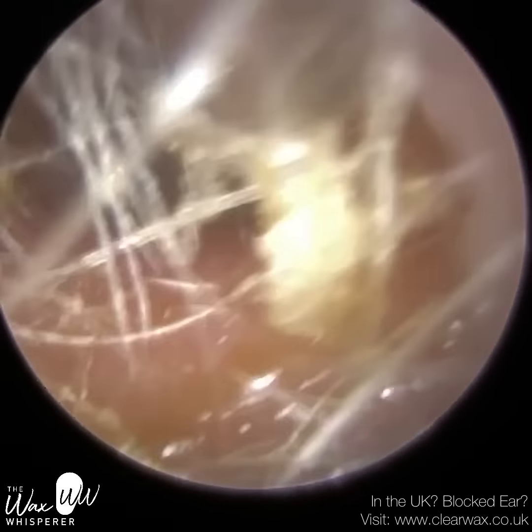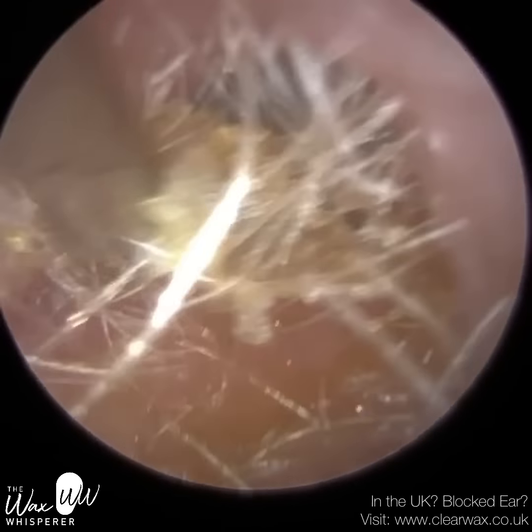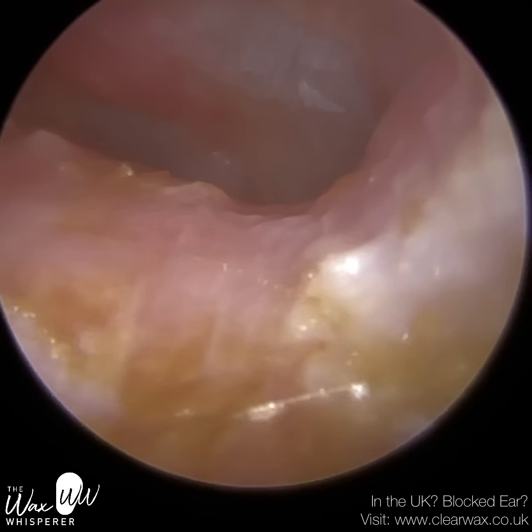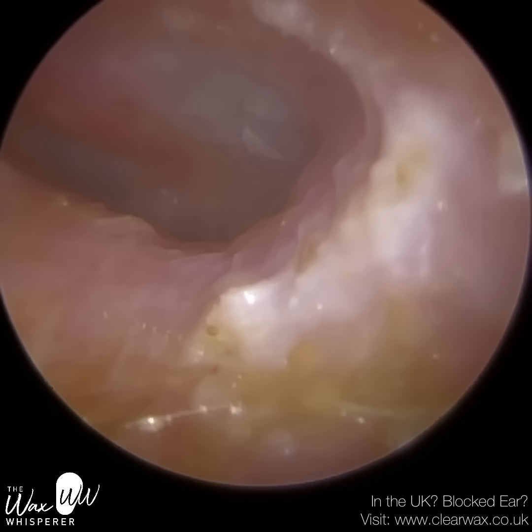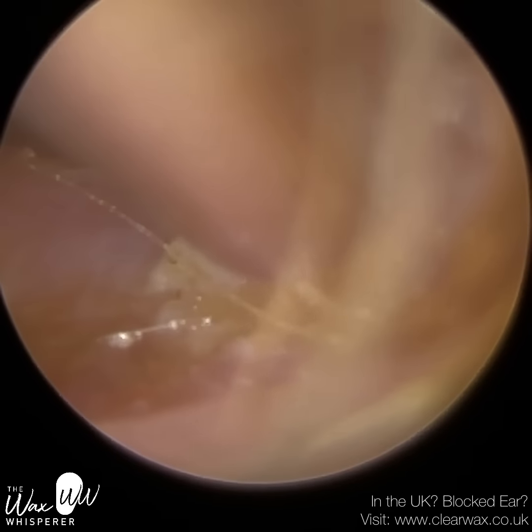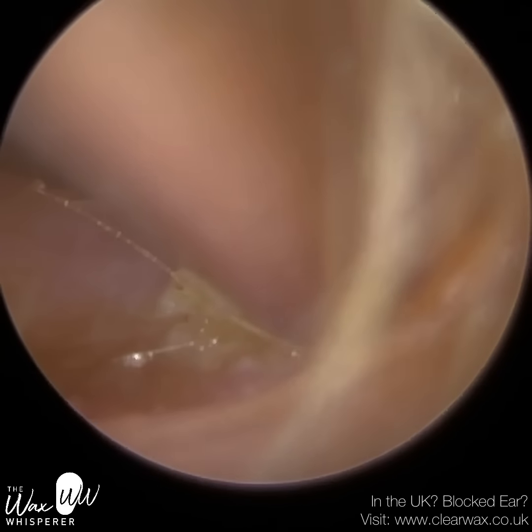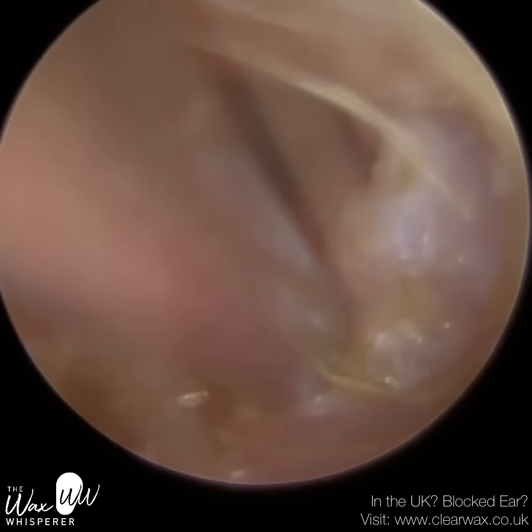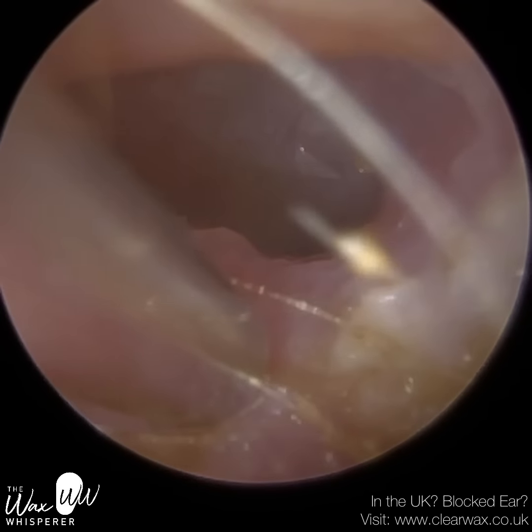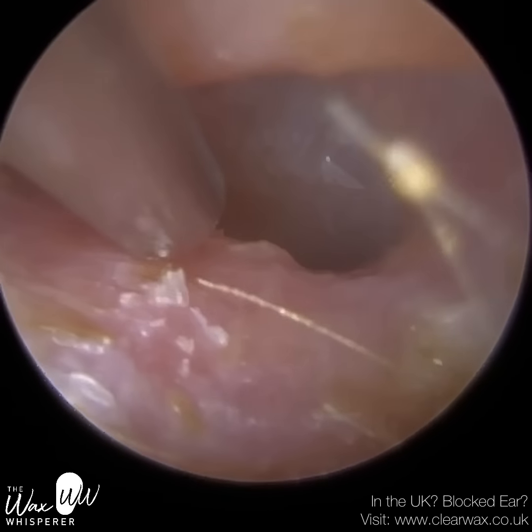So again, it's just a bit more skin at the entrance. This is a bit more crusted, this skin. And it's also matted itself against the hairs. And you can just see, just near the entrance, at the floor of the ear canal, there's a little basin here. So I think I'm standing up at this point and I'm just angling the endoscope downwards into this pit area, because you have some skin forming here. And I'm just gliding the fine end over. Obviously we don't want to graze the ear canal, so we're going to get as much out as we can without causing any discomfort and pain to the patient. And I think we're more or less about there.